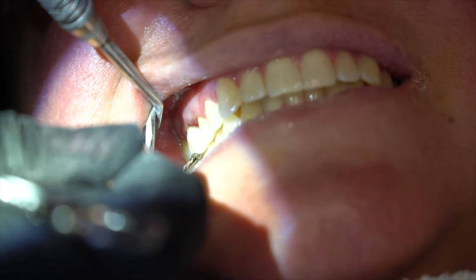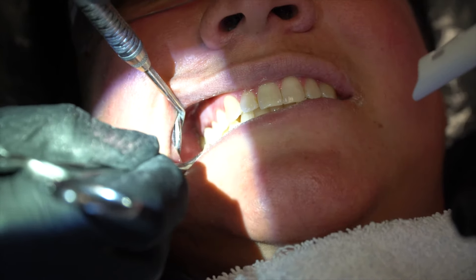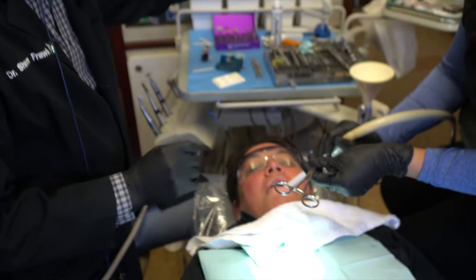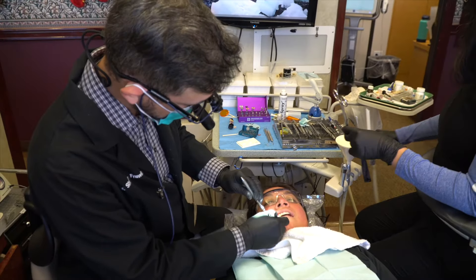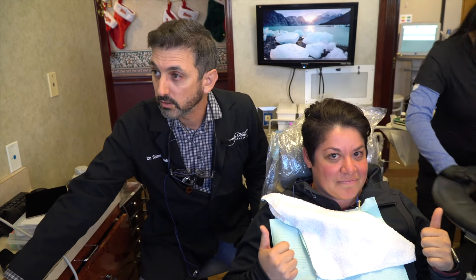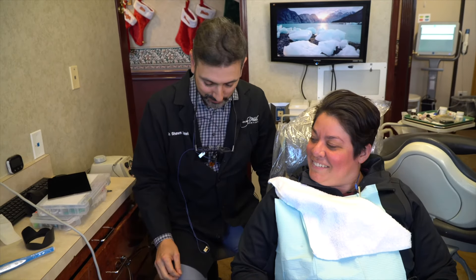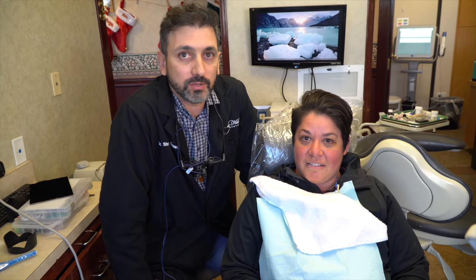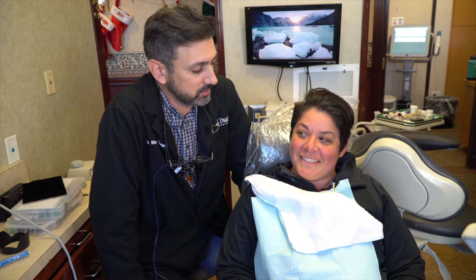Now we're going to check the bite — open, bite and squeeze. Good. The fit is excellent and we don't need to make any adjustments to the bite. So we finished up our procedure today. I hope it wasn't too bad. — No, it was great, thank you so much. — You got some good dentistry done today that's going to last a long time. That's what's important — doing healthy dentistry that's going to serve our patients for the years to come.